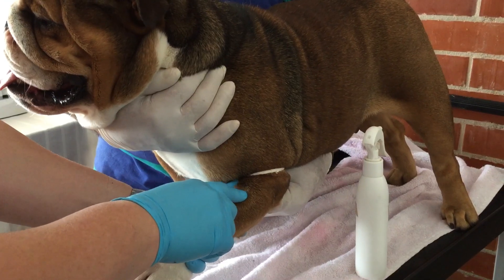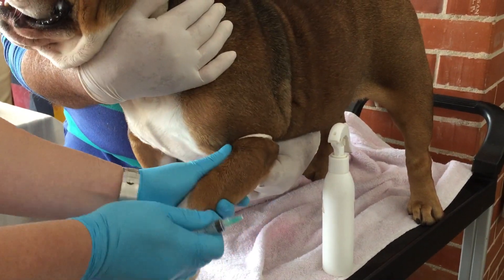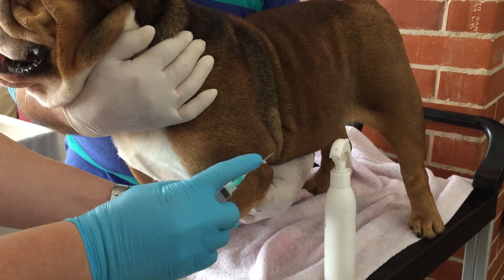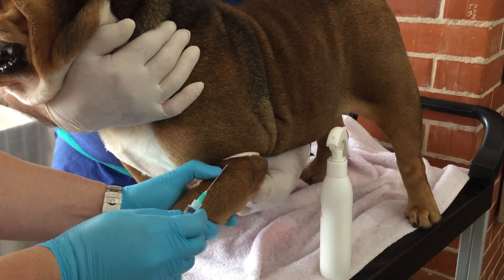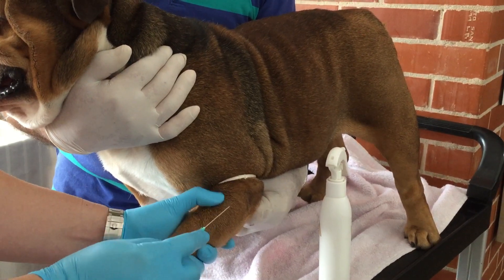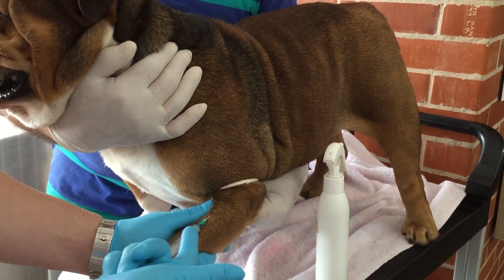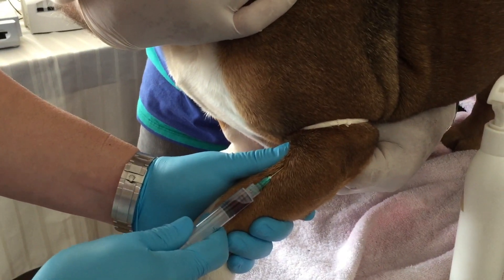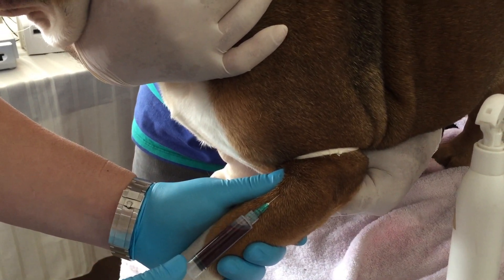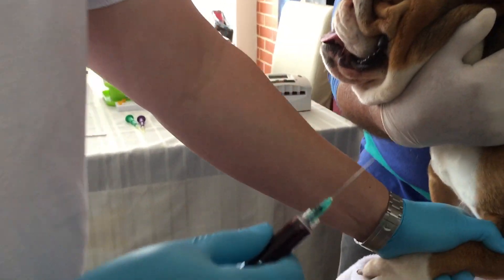You want to put your thumb against where you feel the vein and all you do is put in the little tip with the hole facing you. As soon as you see blood, that's it — you don't need to push it in more, just a little bit, then start pulling backwards. There's the blood. Start pulling backwards slowly and get about five cc's, then press your thumb against here and wait a couple of seconds so no blood comes back out.